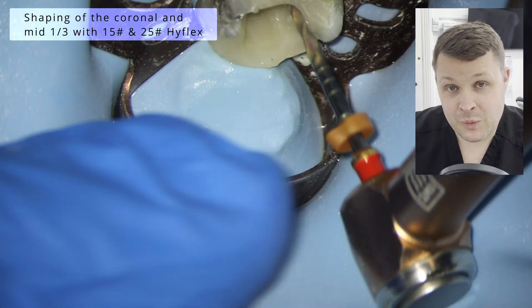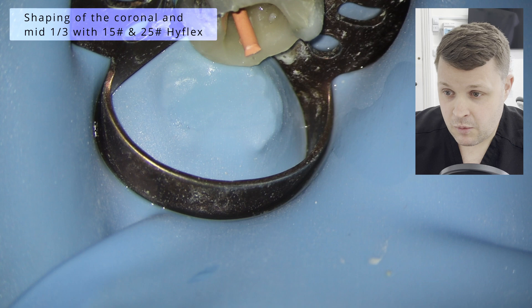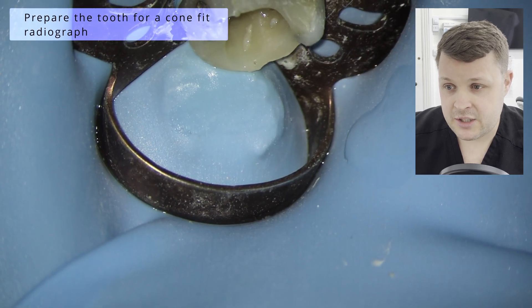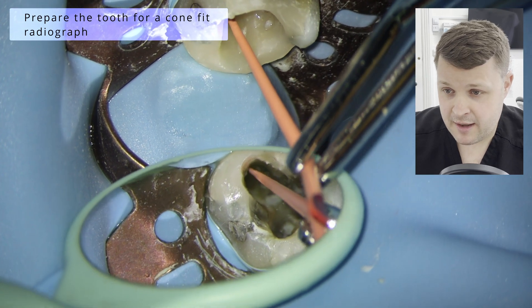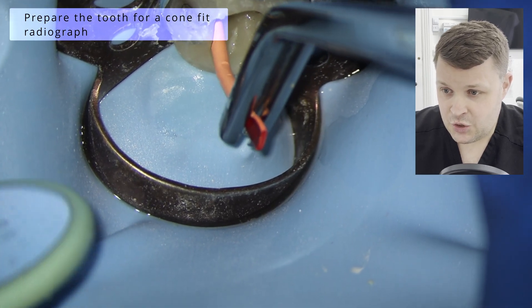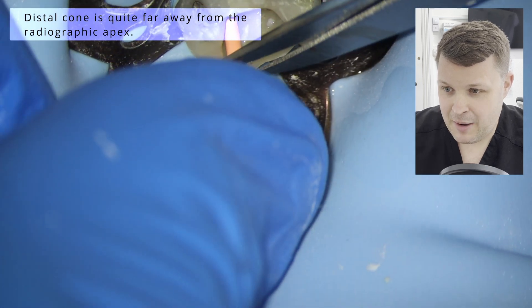Some people might say 25 is too large in this case, but to be honest, I'm just getting to the point now where these small preps are really, really difficult to manage. And then we're going to prepare for the cone fit radiograph. I like to make sure we get tugged back and I like to snip off some of the GP points here.